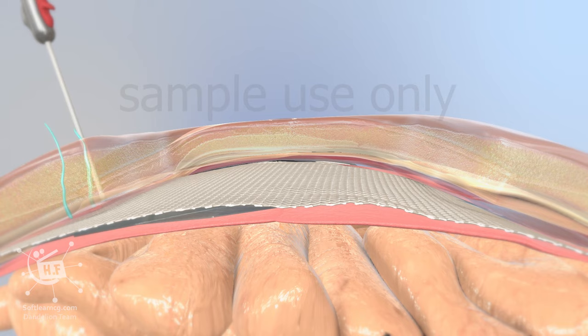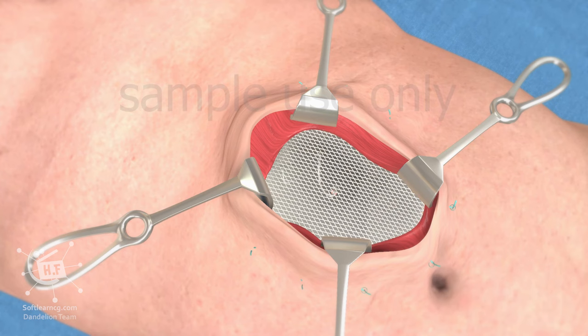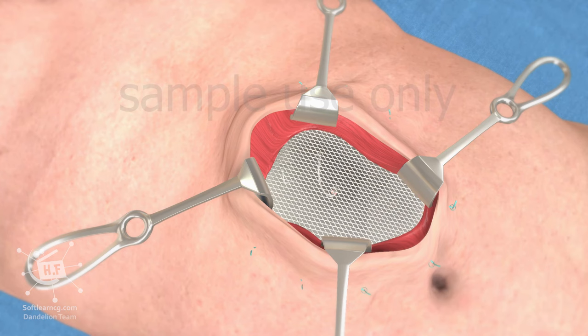The advantage of the foldable retractor over the spatula is that it expands to cover the entire abdominal wall. The benefits of using this device include the need for only one physician, a reduction in operating time by one third, and the obvious safety benefits.